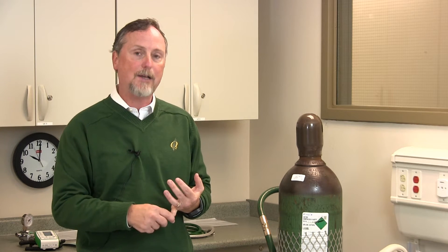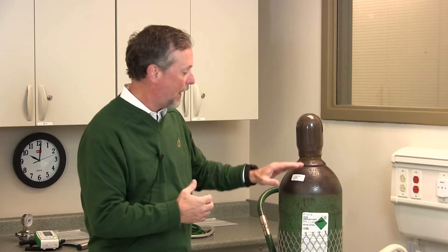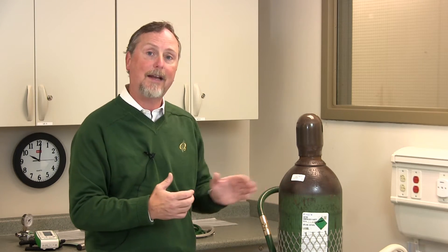Heliox cylinders come in three basic contents: 80-20, 70-30, and 60-40. The two most popular tanks being used in the hospital today are really the 80-20 version and the 70-30 version. This happens to be an 80-20 version tank, and it's very important when you look at the label that you find that it is 80-20. The Heliox blender concentration must be matched with the tank. So an 80-20 tank will call for an 80-20 blender, and a 70-30 cylinder will call for a 70-30 blender.